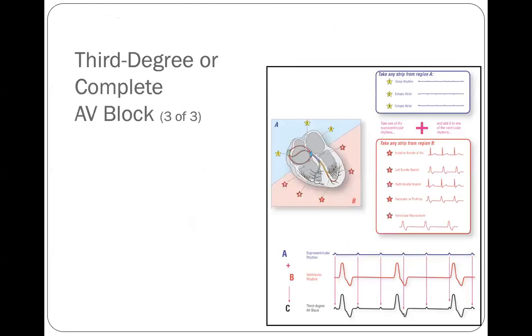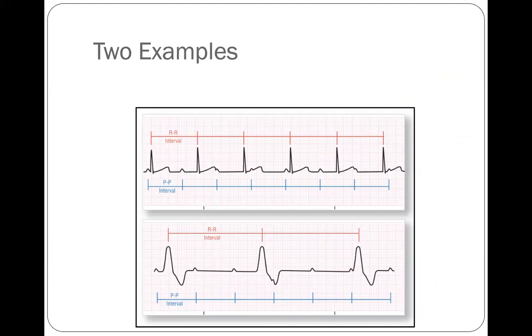The appearance on the EKG depends on where the ventricular pacemaker is located — QRS complexes can be narrow or wide, though they are commonly wide. You have an atrial rhythm, a ventricular rhythm, and what you see on the EKG is a compilation of both together. Two examples are shown: one with a third degree heart block and narrow QRS complex, and one with a complete heart block and wide QRS complex.